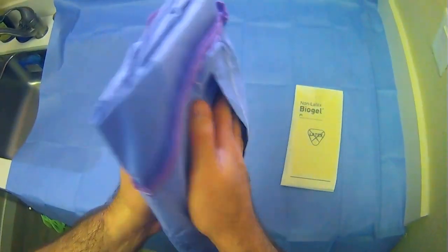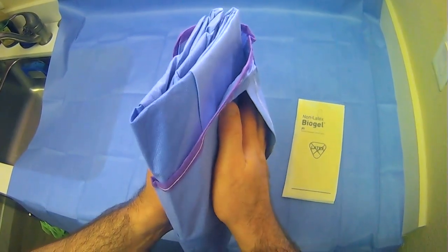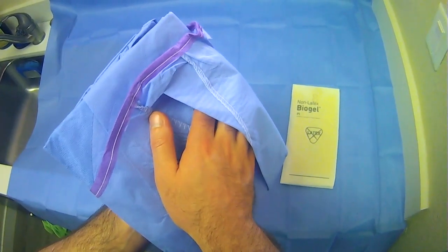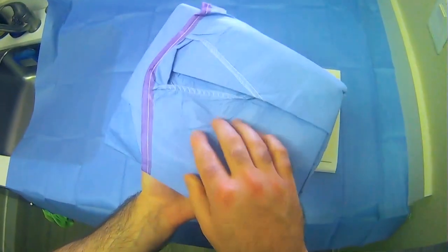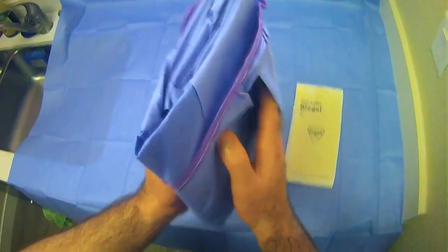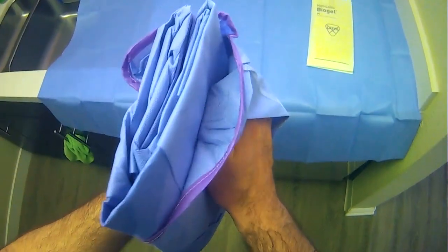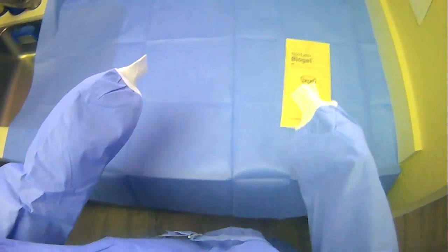So it's going to be one fluid motion where you open up the gown and push your hands through the arms of the gown. All right? So the important thing is that you grab it from the table without touching the table, and then you only touch the inside parts here, and then pay attention, because it's going to be quick. You step back to give yourself room, then you just open up the gown, and then here you are.